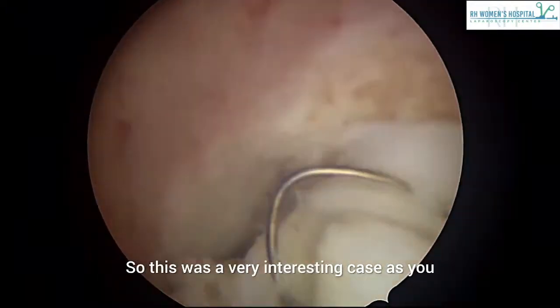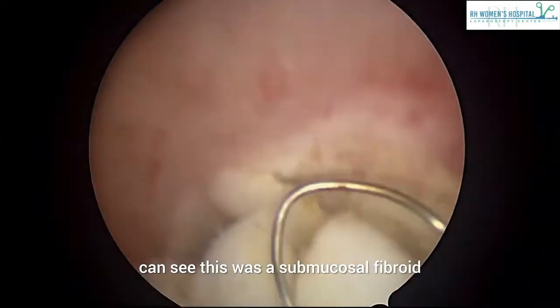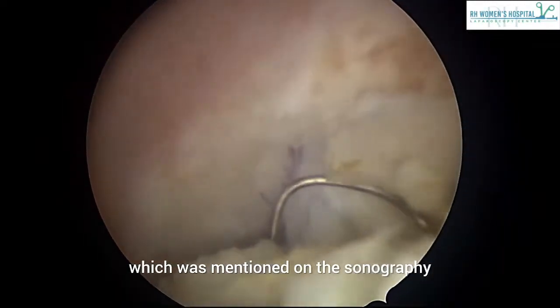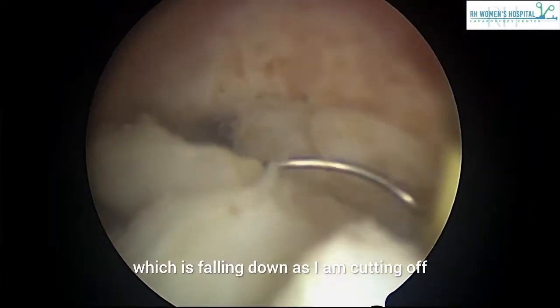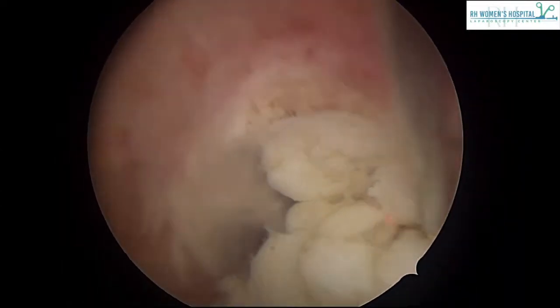So this was a very interesting case. As you can see, this was a submucosal fibroid which was mentioned on the sonography, but actually it also had intramural component which is falling down as I am cutting off the fibroid pedicle.